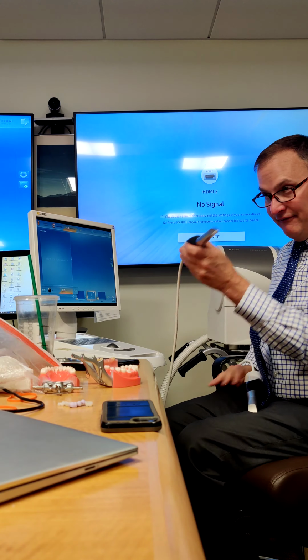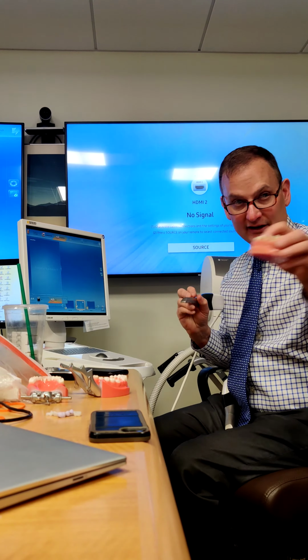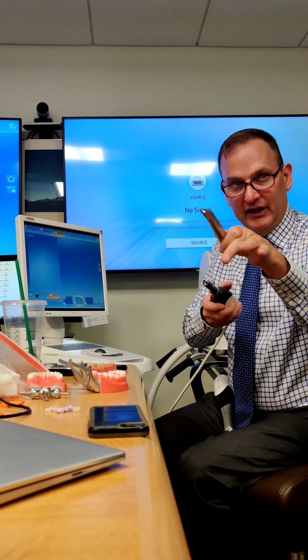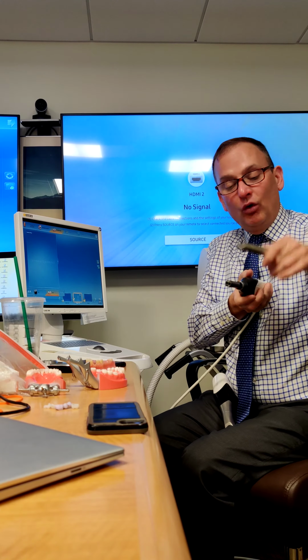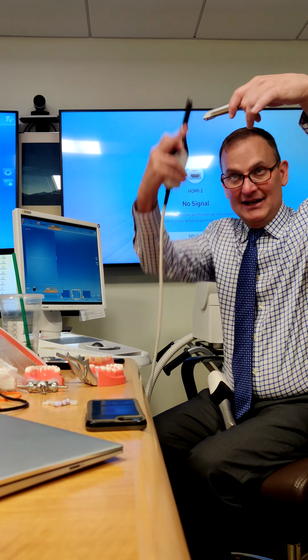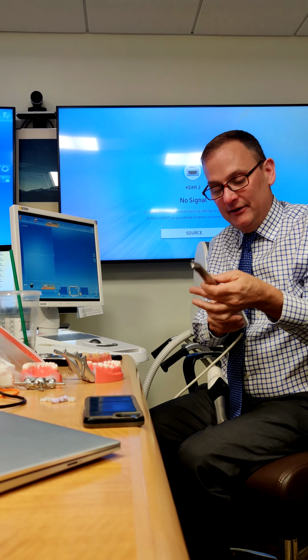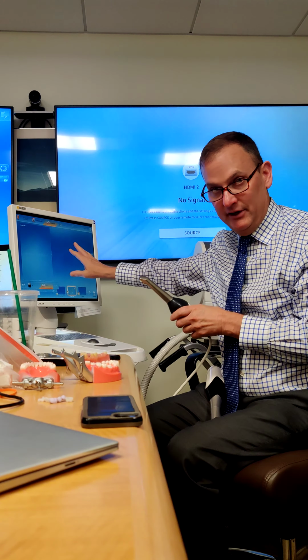One of the things that you may find when you're scanning with OmniCam that can be frustrating is trying to get contacts. Has everybody had that? The issue is the camera is here. This is the camera and it's looking forward and it looks into this mirror and the mirror's pointed back. So when you're scanning, you're not scanning down, you're scanning back at an angle. Does everybody see that? This angle is what it's scanning at. Because this is the camera looking into that mirror, okay?